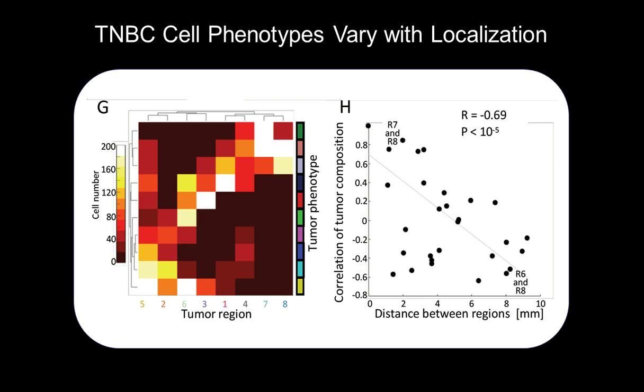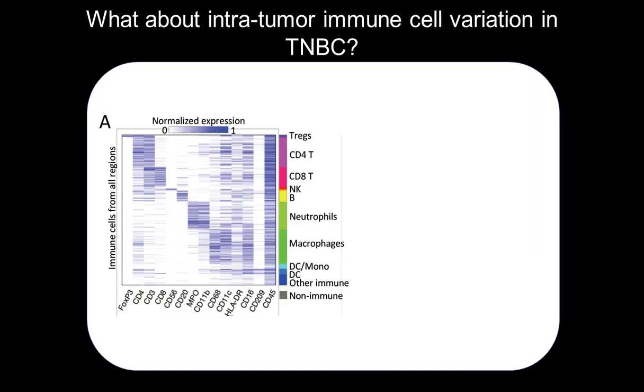So that was interesting because it outlines a summary of tumor heterogeneity, and it actually shows that you get a phenotypic kind of evolution across the tumor that is much in line with how we think you also get clonal evolution within a tumor.